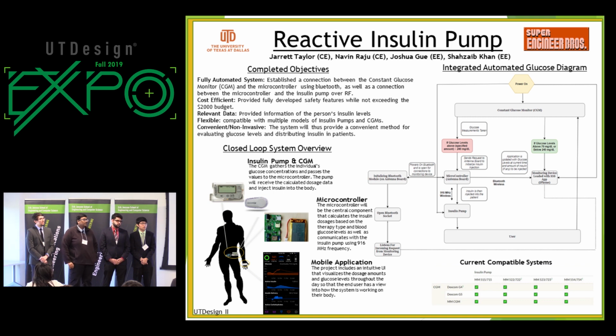So those algorithms and those guidelines, as you do this closed loop system, did you think about what the FDA guidelines would look like, or any preparation thought about that? I'm sorry, meaning, when you built your algorithm, did you keep in mind some of the FDA guidelines that would have to go? Yeah, we referenced published papers as well as endocrinologists that live in the area. These are common dosage algorithms that people are using to manually input. So we're using common knowledge algorithms for type 1 diabetics.